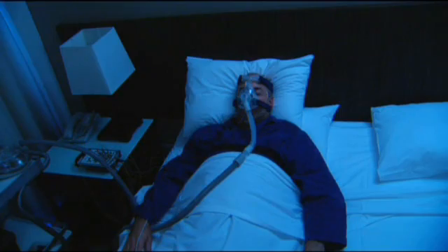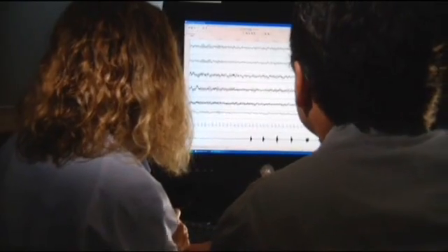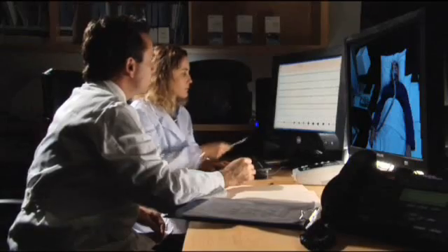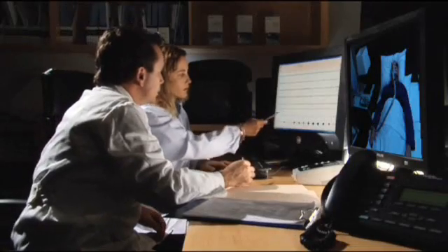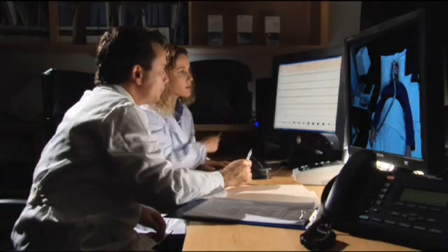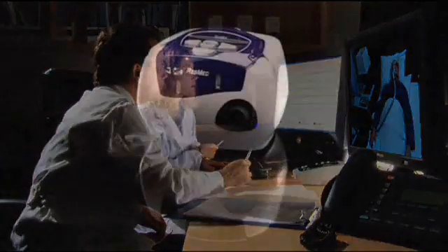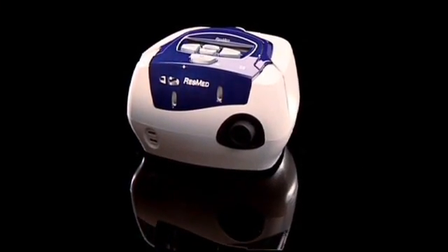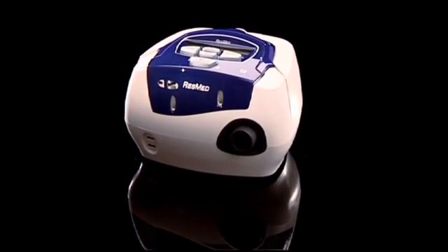Recording and accessing sleep data is vital for effective and compliant therapy, and patient management is quick and easy with ResMed's new S8 series.